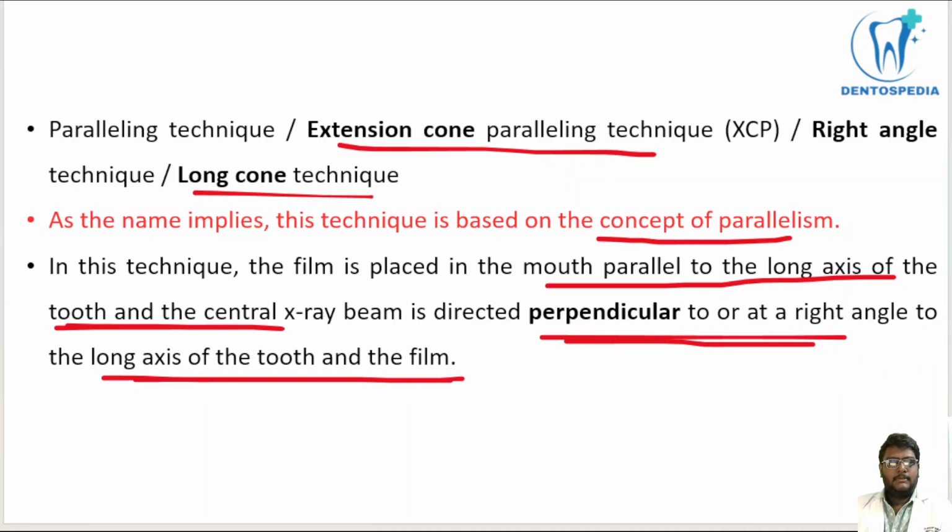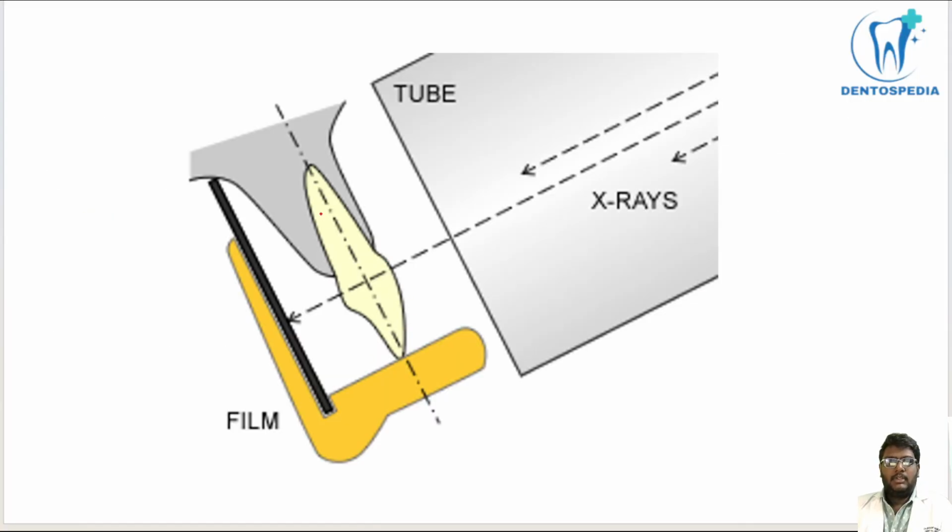That's the main difference. You can see in this picture, this is the film, and this is the long axis of the film, and this is the long axis of the tooth, and they are both placed parallel to each other with the help of a specialized holder.